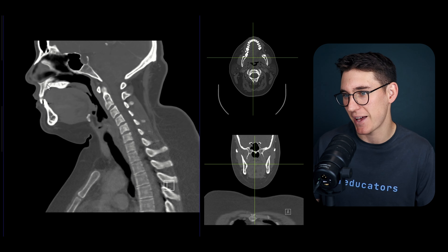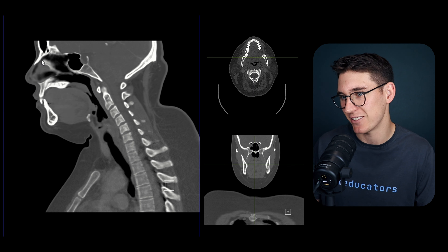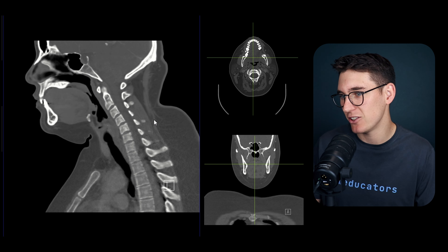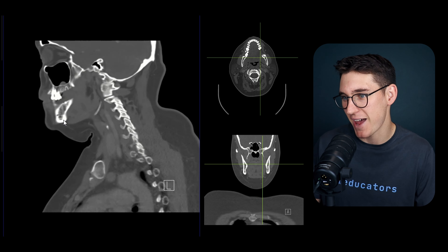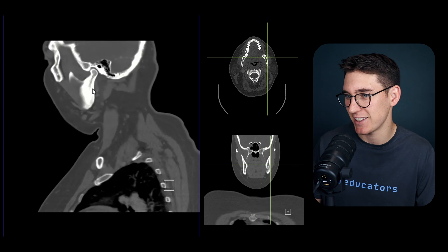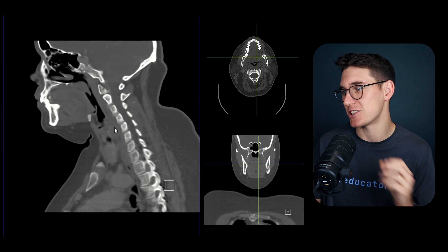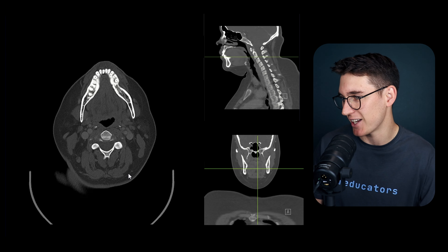On our sagittal slice at the midline we can see the palatine process, the incisive foramen, the alveolar process of the maxillary bone, and the nasal bones. Below the maxilla and the upper teeth we have the mandible - the lower jaw. Extending laterally, we can see the mandible wrapping all the way around. Heading to the axial slice and going down, we can examine the mandible, which houses the lower teeth.